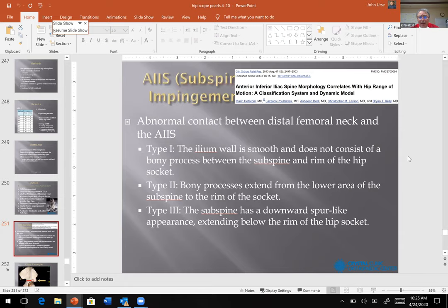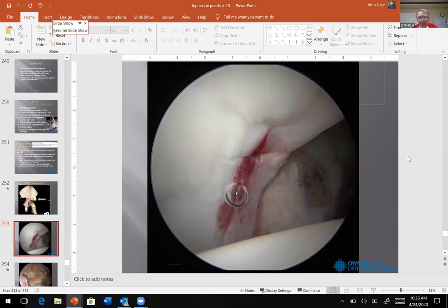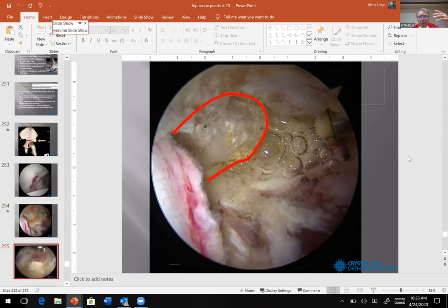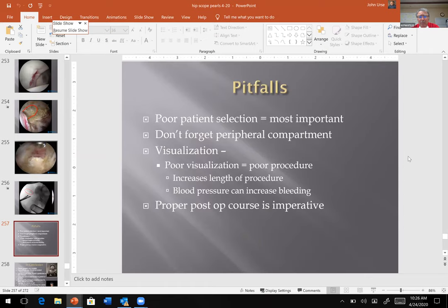So AIIS, or subspine impingement, there's a couple of different types. All you need to know is that the area that the AIIS hangs lower and it can impinge. This is a 3D CT showing the subspine impingement, and it can cause a tear in the labrum. And this bony overgrowth, you can take a burr to it and you can actually just get rid of that. This, again, is one of Joe Van Laskowski's slides. Thanks, Joe Van, for that. But if you can't see what you're doing, you're going to get problems.